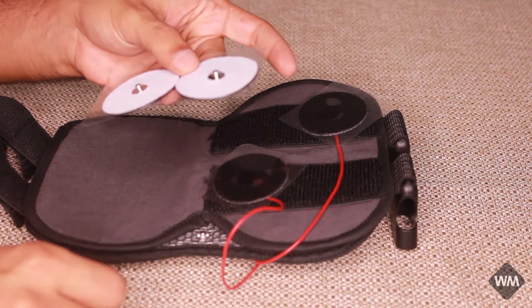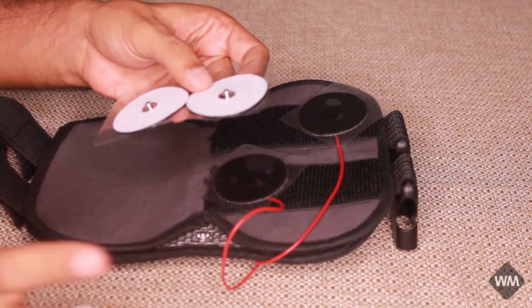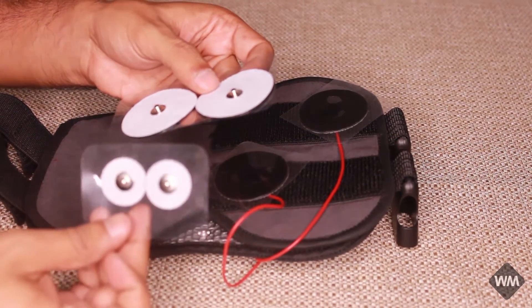With larger electrodes, at times certain patients show a lot of aversion. So, to reduce aversion, smaller electrodes can be used.